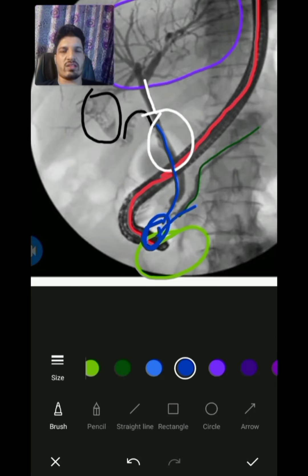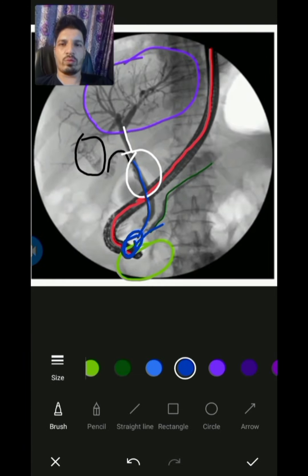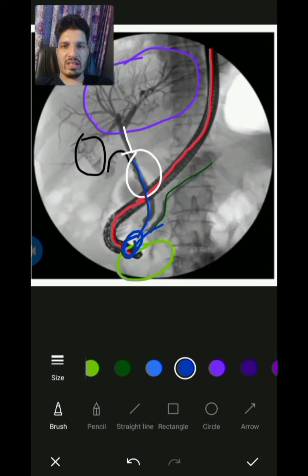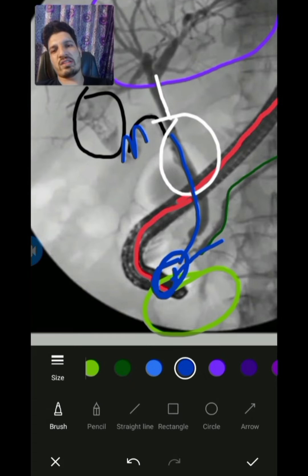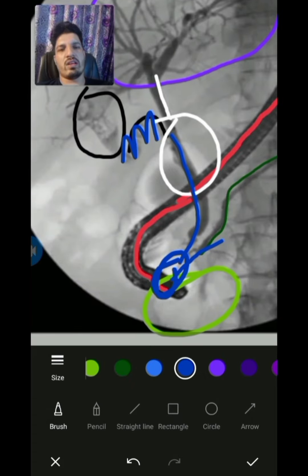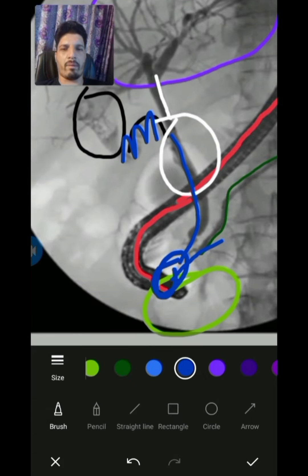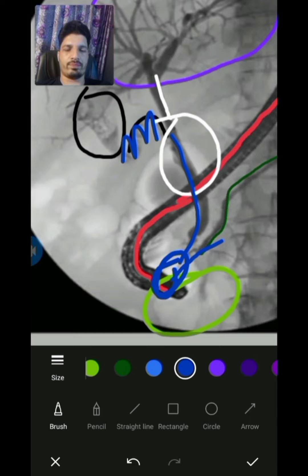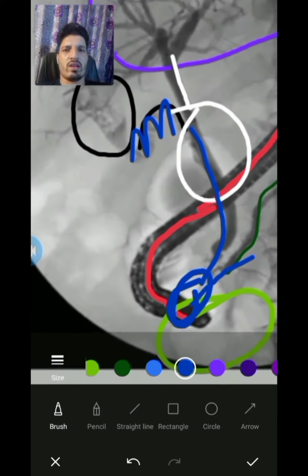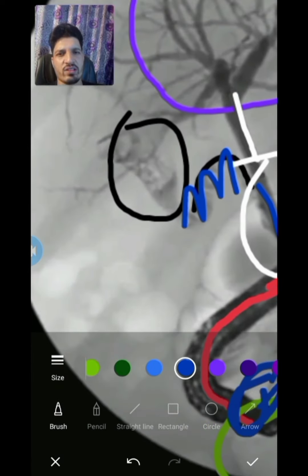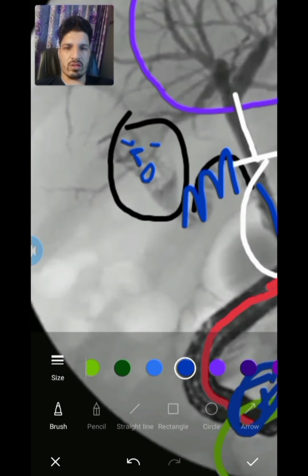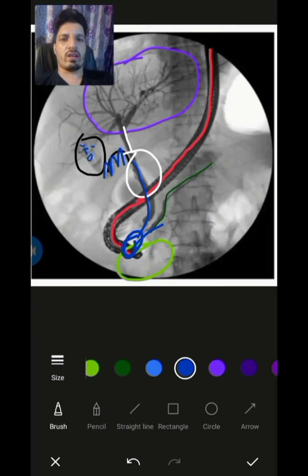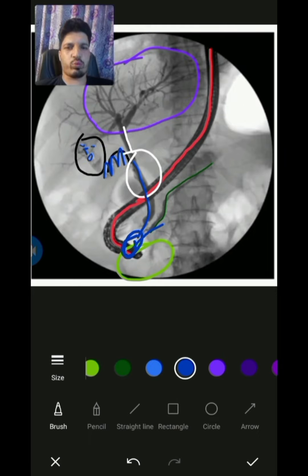By now you must be very clear about the anatomy of this system and you will be able to read ERCP in a very clear way. Here you are seeing the pattern of the cystic duct, and you might be seeing that there are filling defects, which are basically due to gallstones in the gallbladder.